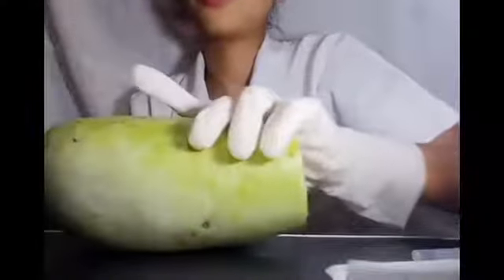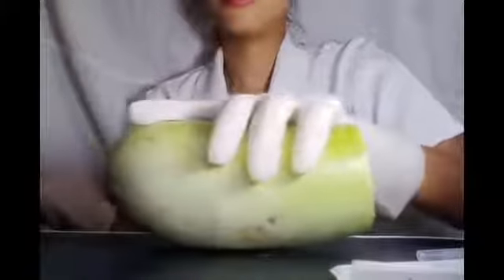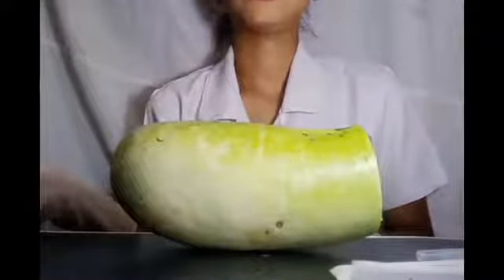So we're ready to inject it in our patient. I have here a vegetable. We will find the location.